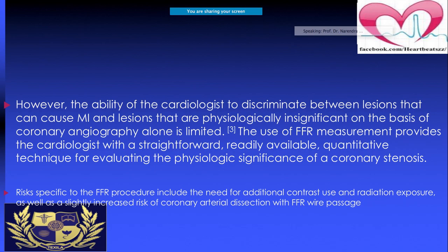The FFR, although it gives a straightforward, readily available quantitative technique for evaluating the physiologic significance of a coronary stenosis. So for example, if there is a coronary stenosis, how much is it affecting the blood flow? And that's what we are interested in, right? And there are also risks which can happen with the FFR procedure.